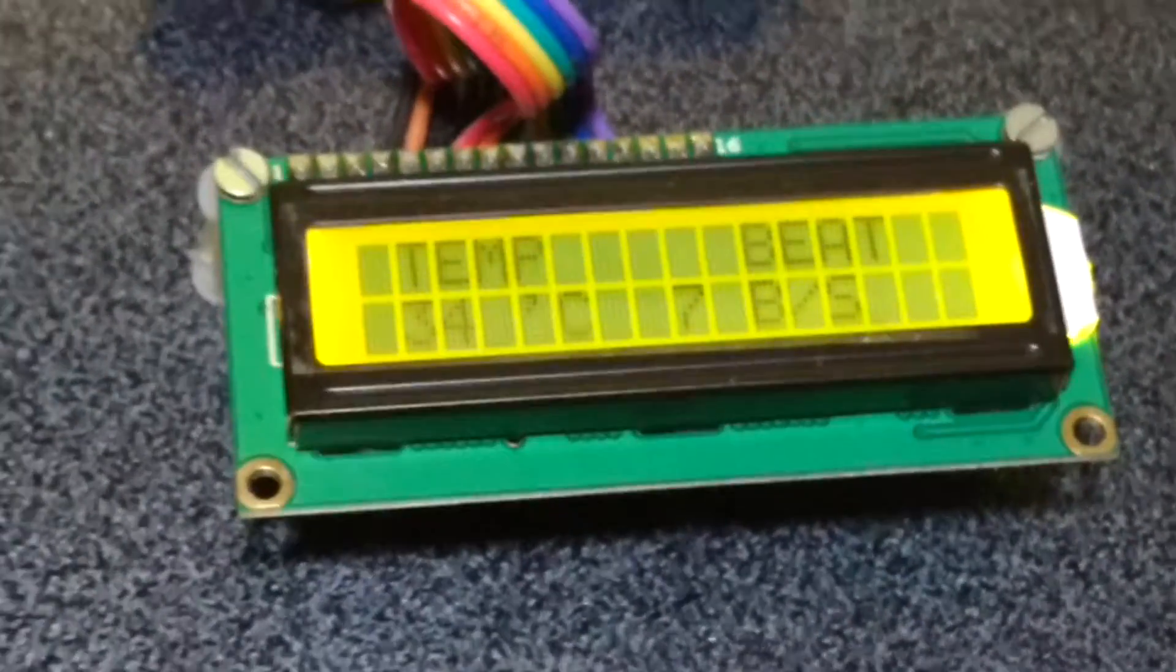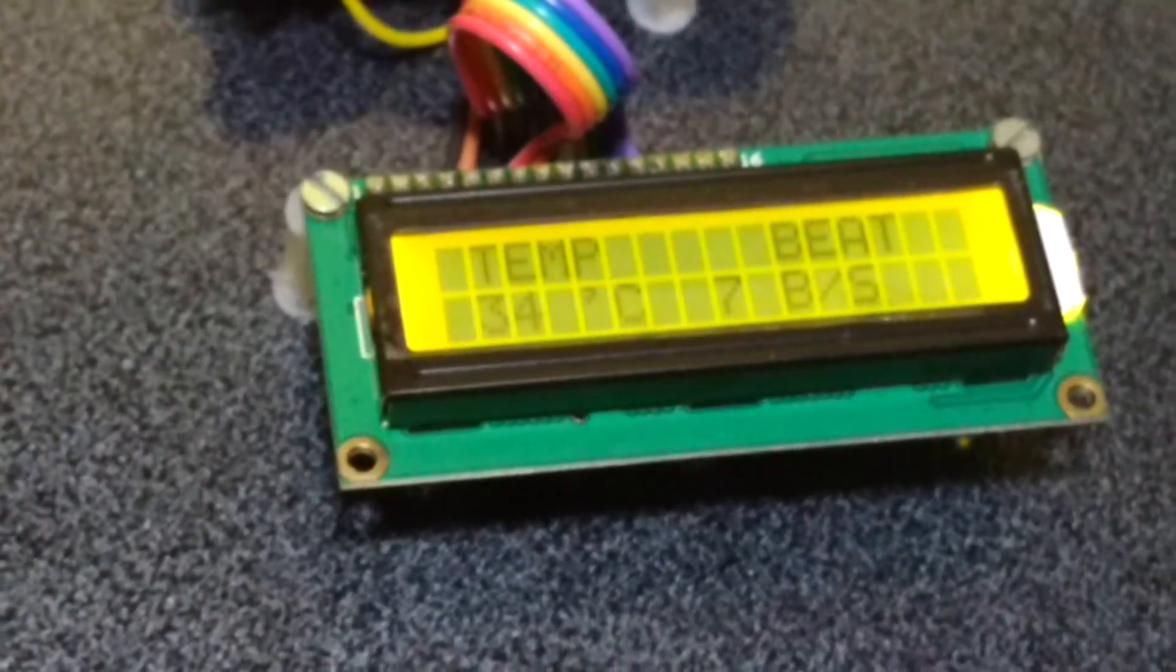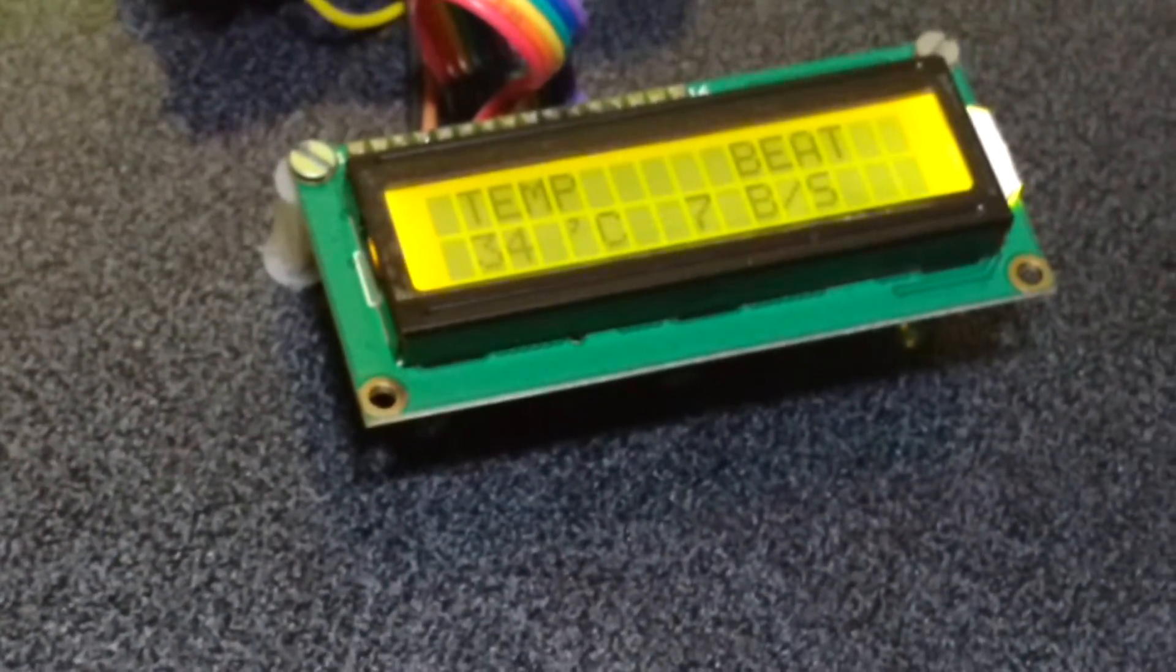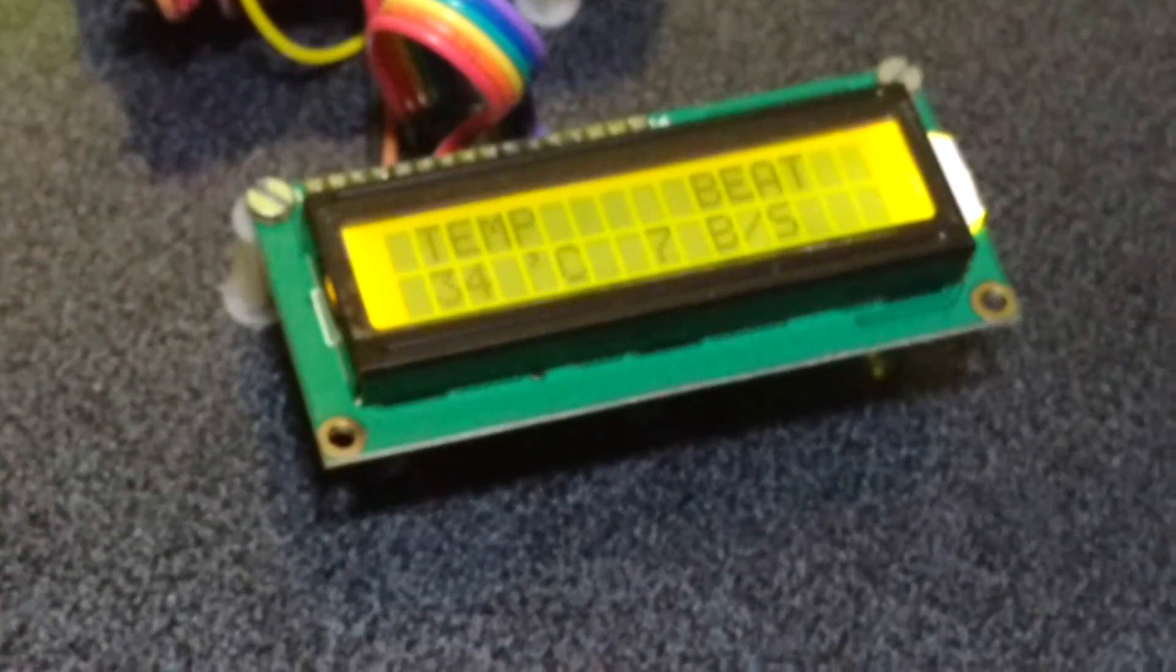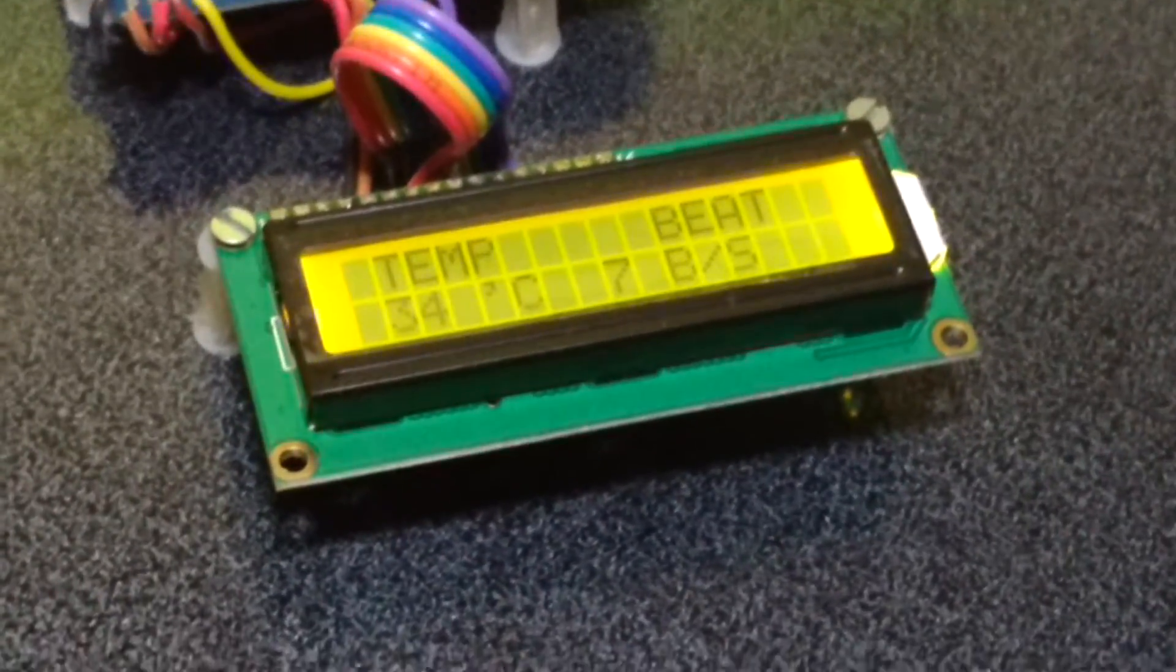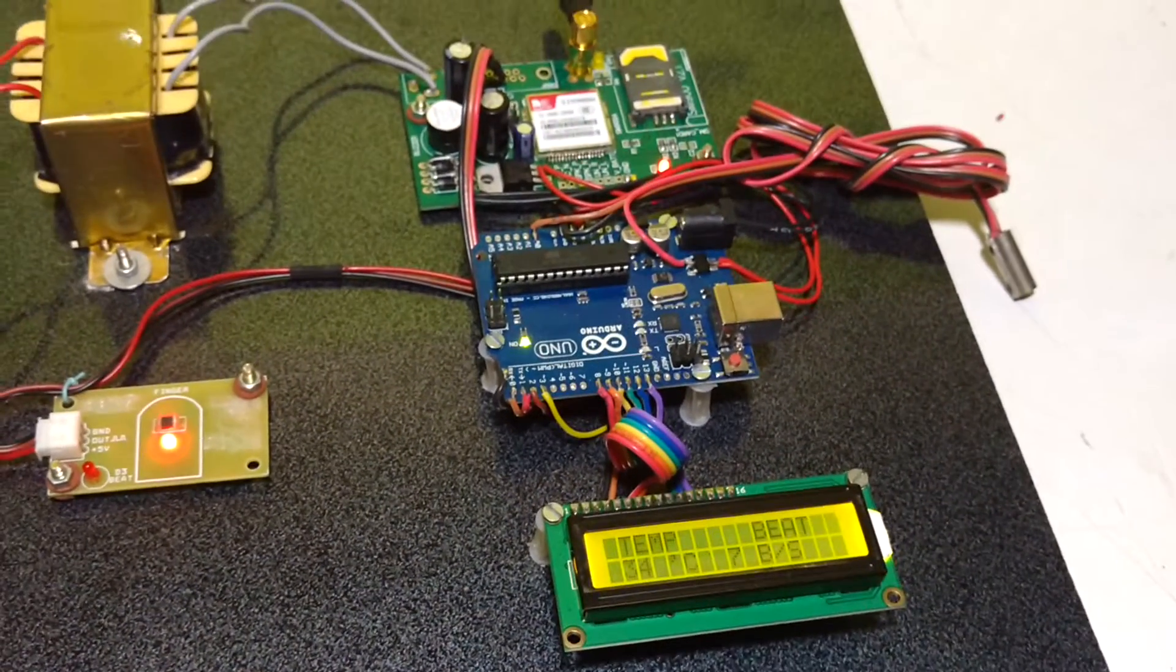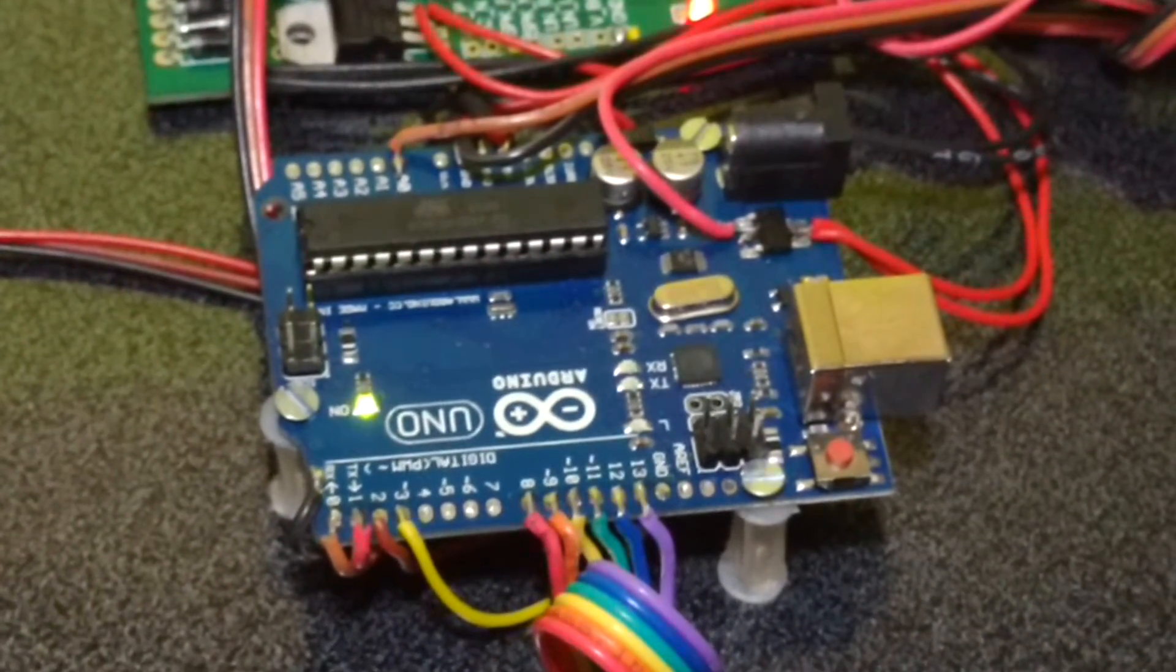Hello friends, here we have our old project patient monitoring system but with new microcontroller, new development board Arduino Uno, which is very powerful.